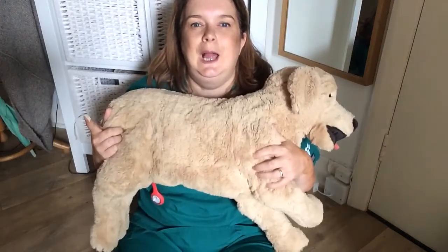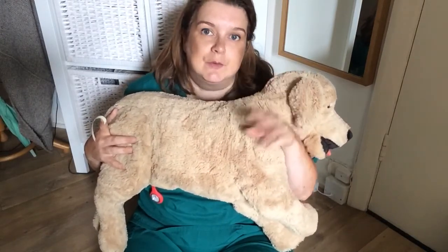So let's get started with imaging. Let's do thorax. We've got three thorax x-rays: a DV, a VD, and a lateral.